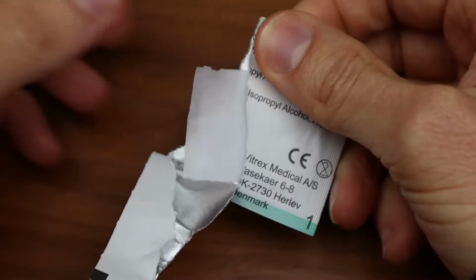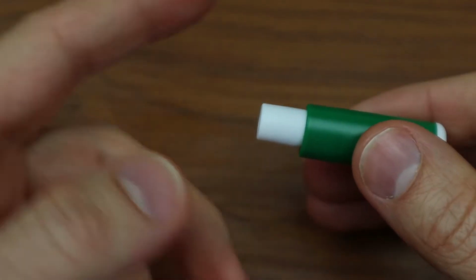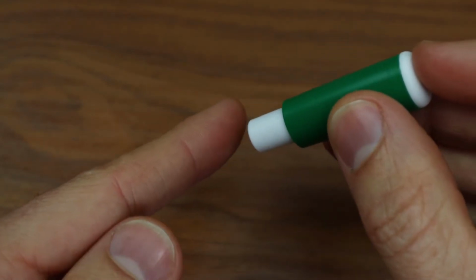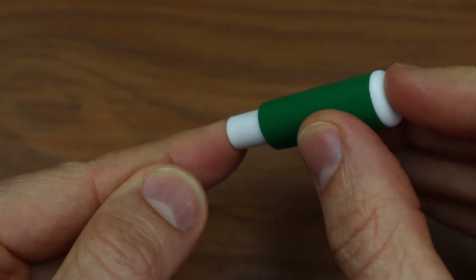Next, open the sterile alcohol swab and clean the tip of your finger. Give it a shake to let it dry and to get the blood flowing. Now grab one of those lancets and twist and pull off the protective cap. These are spring-loaded for one-time use, so be careful not to push the white part into the green part just yet. They provide 2 of these in the kit, just in case you mess up or if you're unable to get enough blood with just one stick.